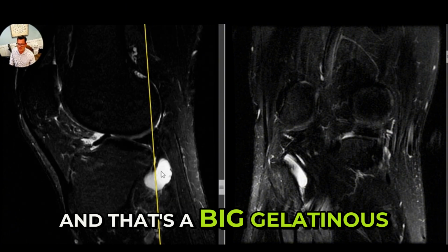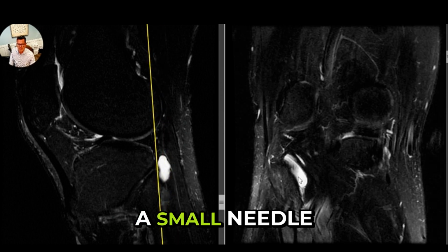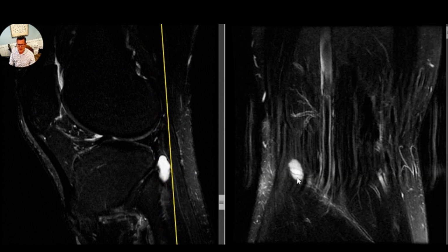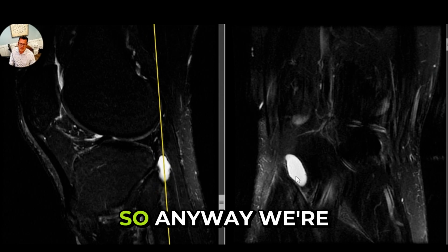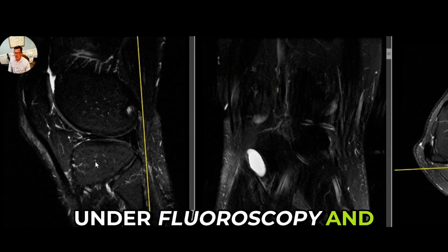And that's a big gelatinous, thick fluid, so you can't really aspirate that through a small needle. So we used an 18-gauge needle to aspirate that with ultrasound. So anyway, we're going to show you these different places where we injected under fluoroscopy and ultrasound.